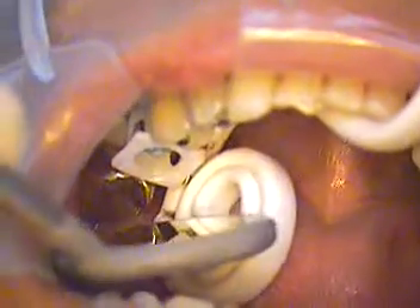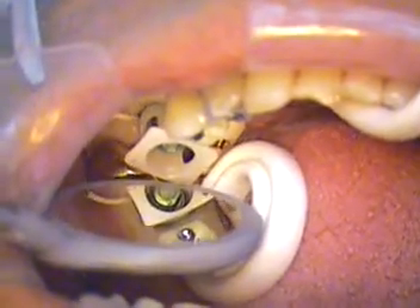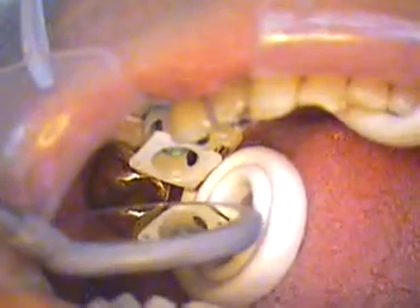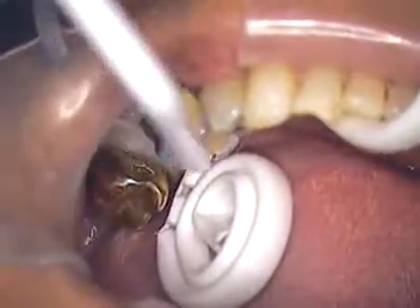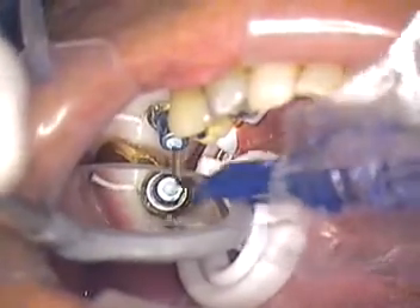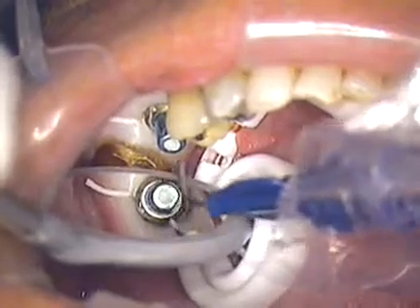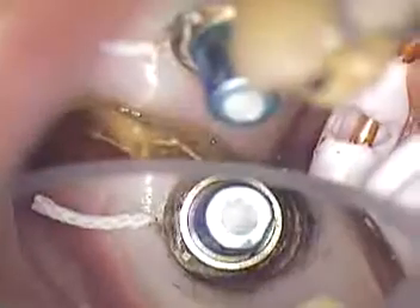Just want to make sure you're still alive under there — we're having fun here. We're going to go ahead and dry this out some more using a 20-gauge syringe needle — that works pretty well, dries everything thoroughly. Now I'm going to pull off that impression coping and zoom in on that abutment. You notice immediately that the Siltrax is visible at 360 degrees all the way around the tooth — beautifully done. Hopefully you guys can see that all the way around in this video.